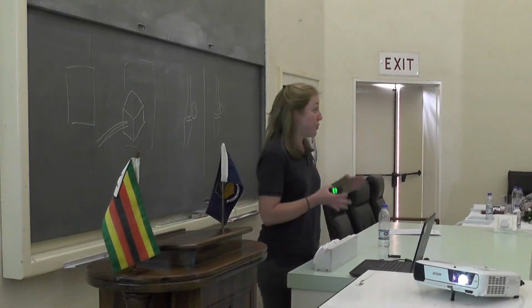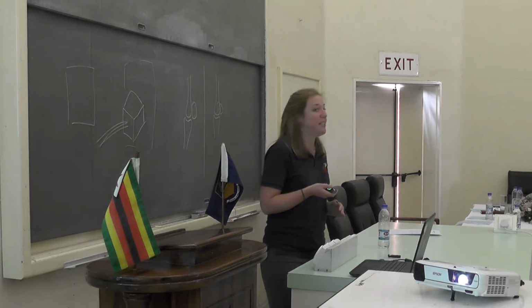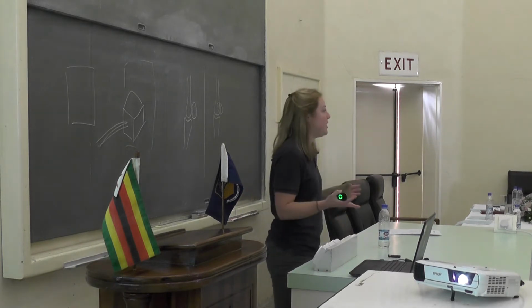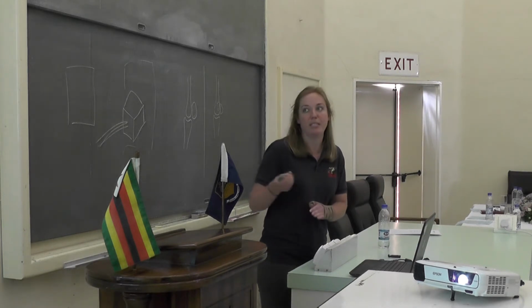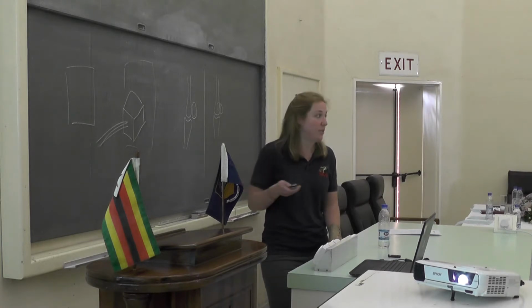Right, so that's the foot. And then the rest of your distal limb, you can essentially apply the same principles, which makes it much easier. So you have 4 routine views for the rest of your distal limb. You have the dorsal palmar, or dorsal plantar, like we've spoken about, which cuts from the very front to the back of the structure. The lateral medial, so from the side to the middle. And these on themselves make a 90-degree angle.